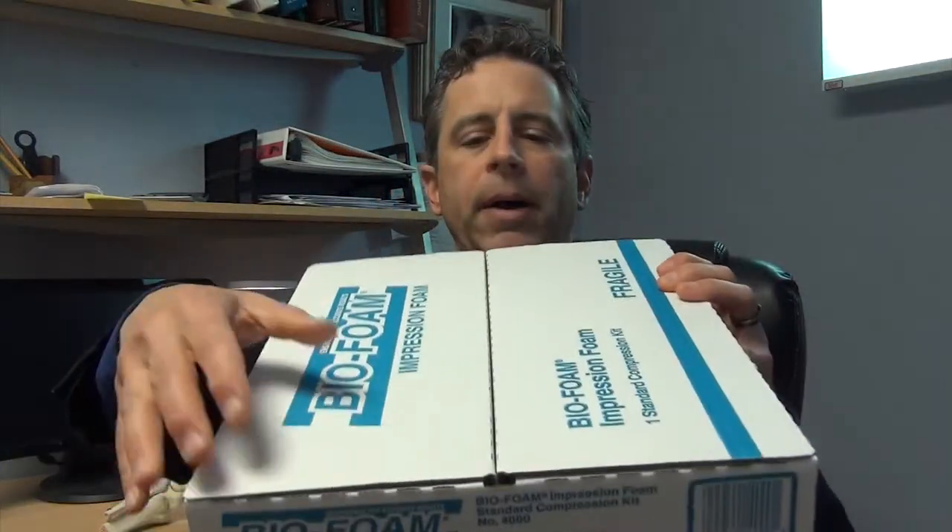Let me show you what impression foam is. Here's a company called BioFoam, and when you open up the box there's a slab of foam on one side and a slab on the other. You may have seen these advertised online — there are a lot of companies that advertise they can make a custom molded arch support. They send you a box like this, maybe not BioFoam but another knockoff brand, and you stand in the foam block, send it to the lab, and they make you your custom device.